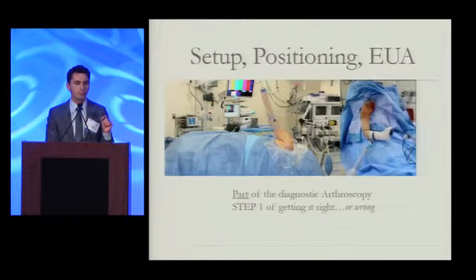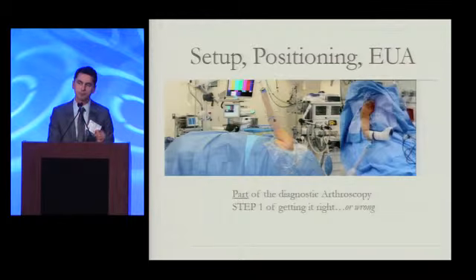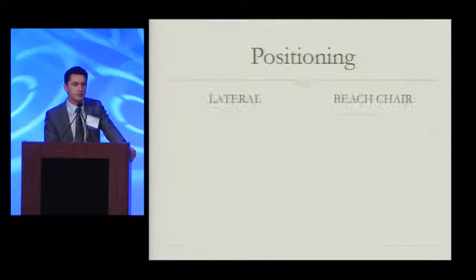And then step one, really, of getting it right. If you set up your patient appropriately, you position everything correctly, that's step one of getting it right. But it's also step one of getting it wrong if you do it incorrectly. So pay attention to these details.